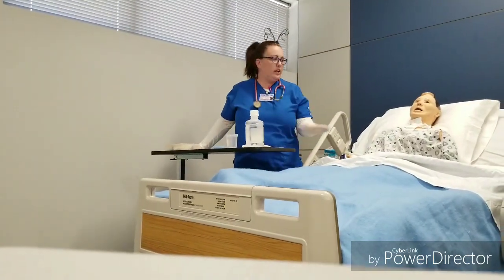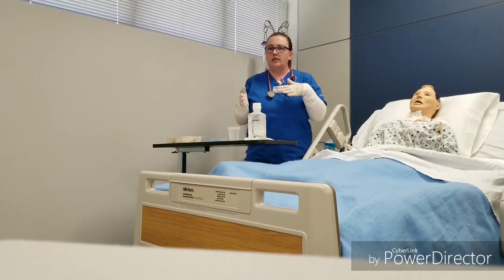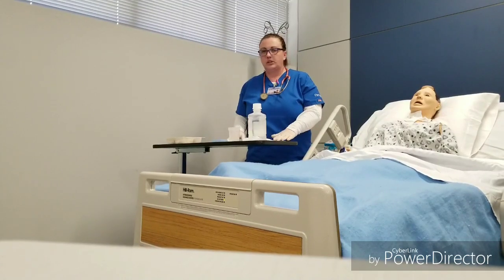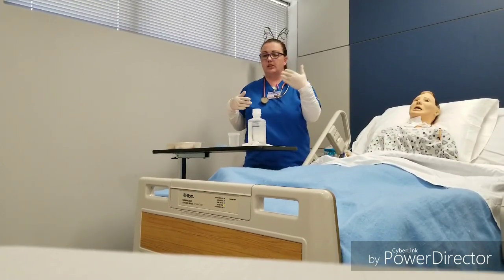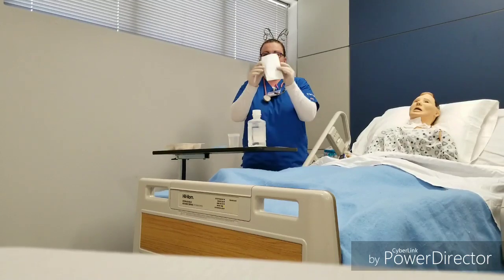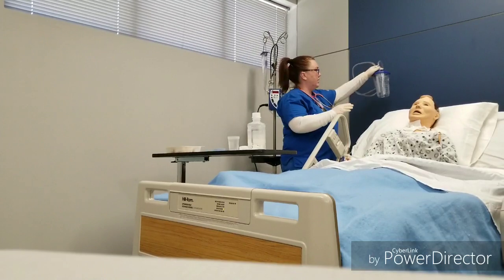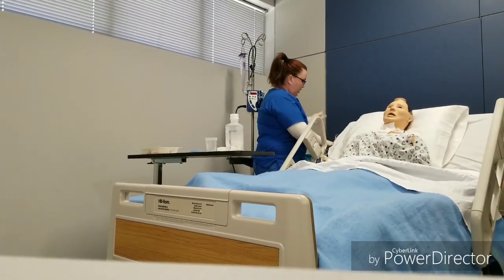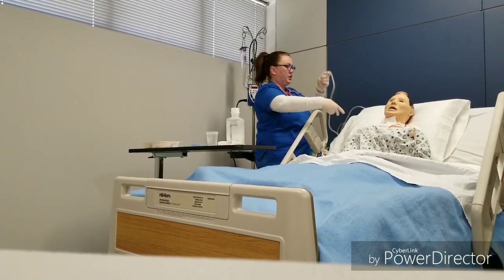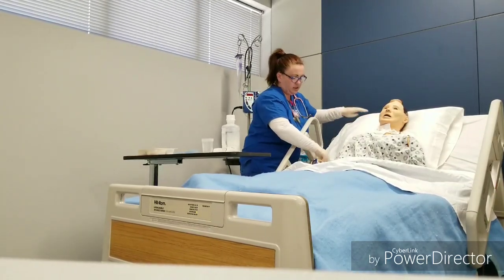Alright, now we're going to move right into trach suctioning. I already applied sterile gloves in the last skill, so I'm not going to reapply them for this skill, but just know this is a sterile procedure and you will need to apply sterile gloves, your saline, your suctioning. You'll have your canister attached to the wall with suctioning and tubing. So I'm going to drape suctioning tubing on the patient's bedside.